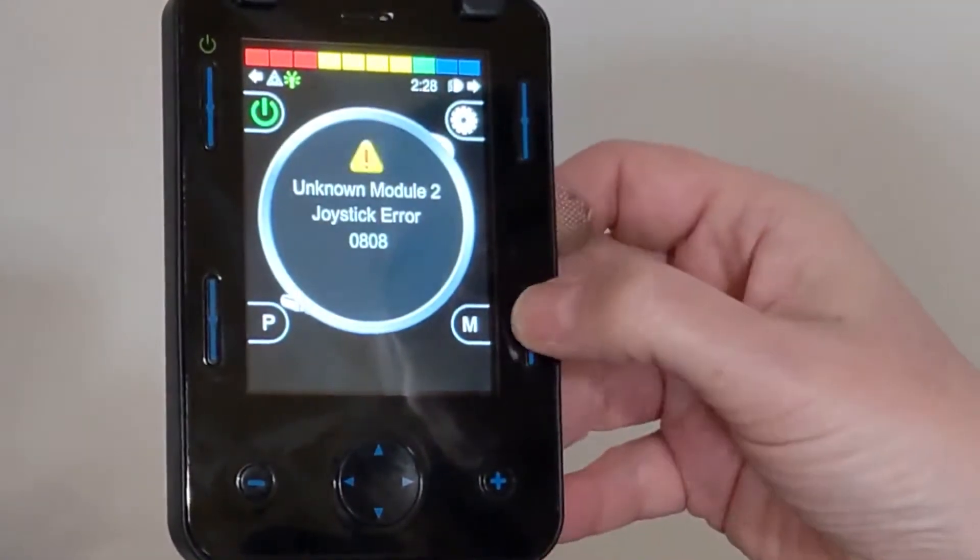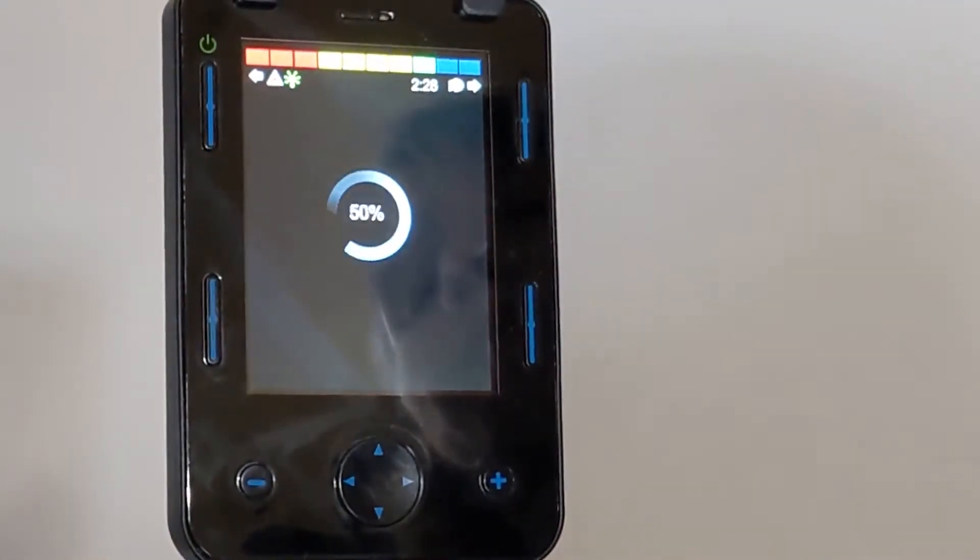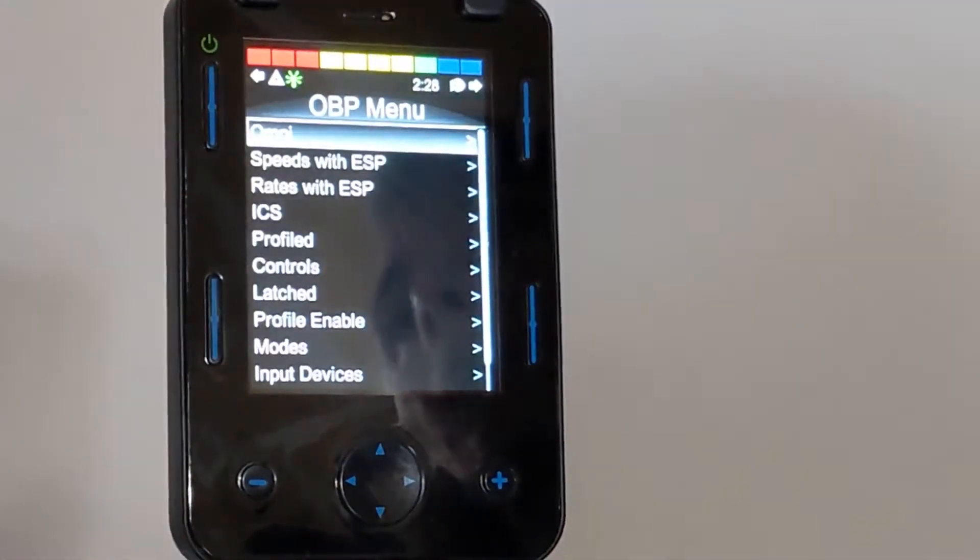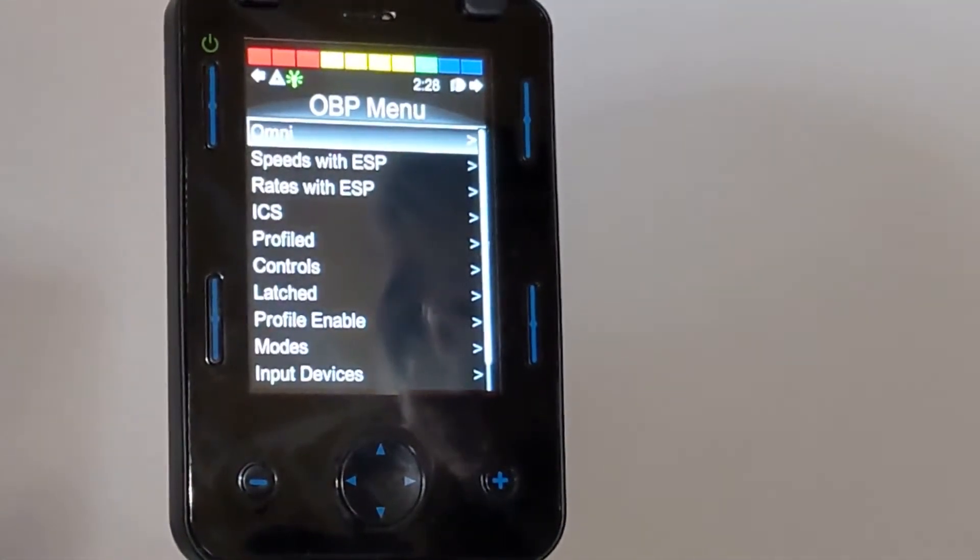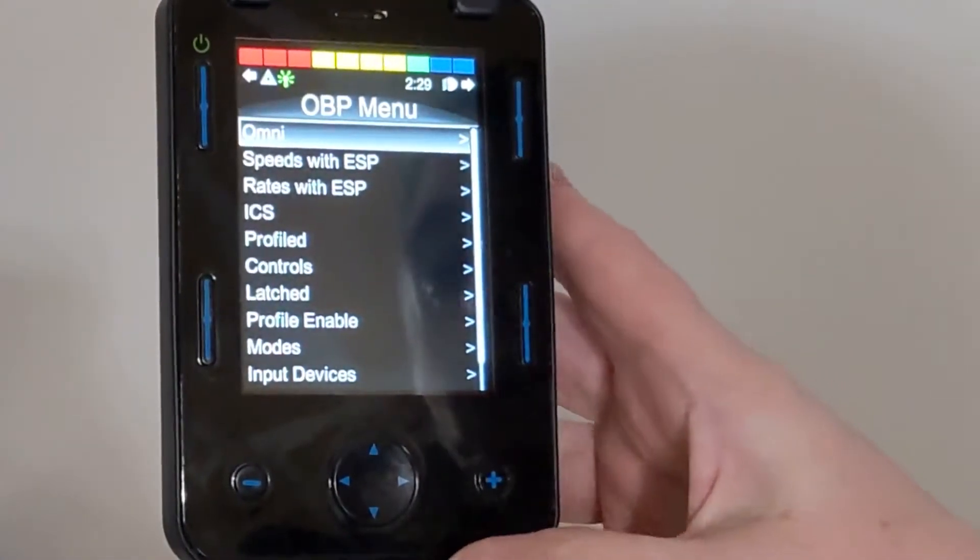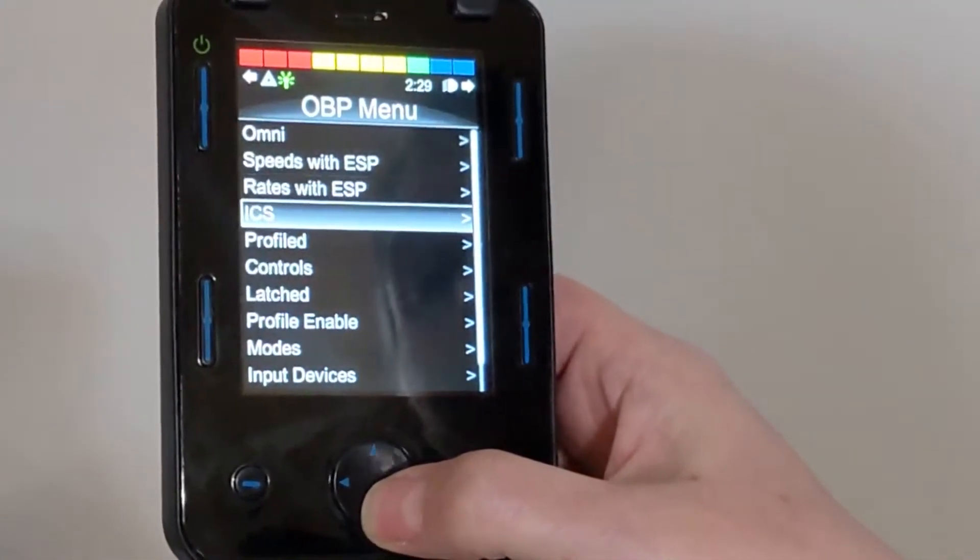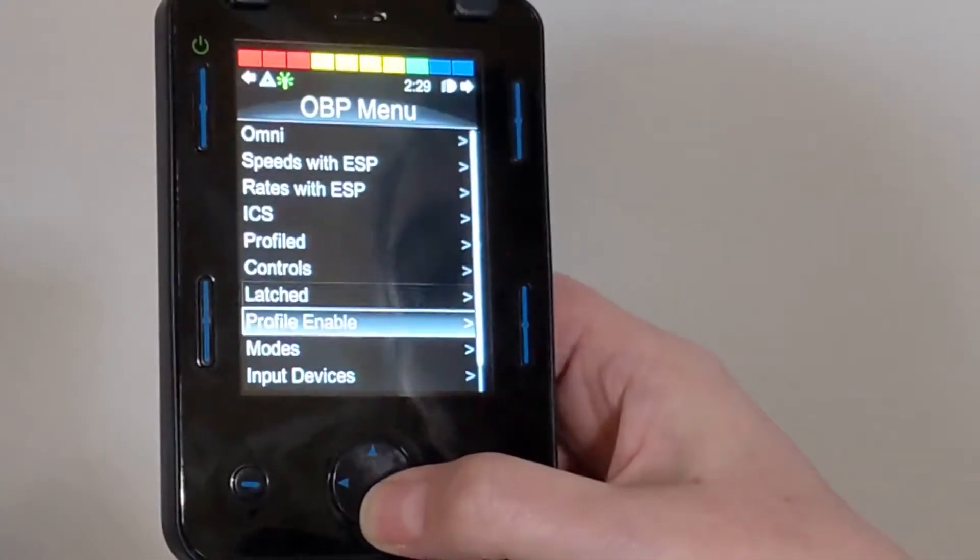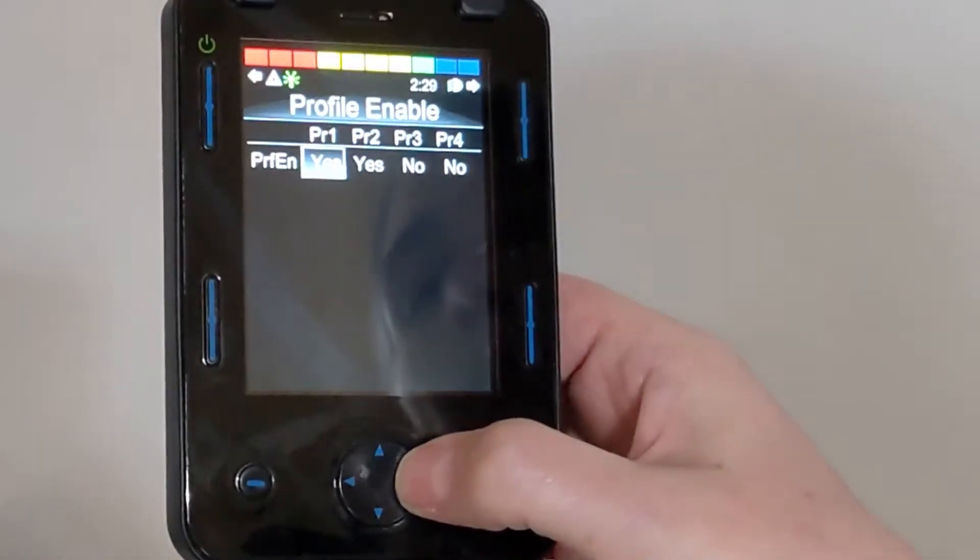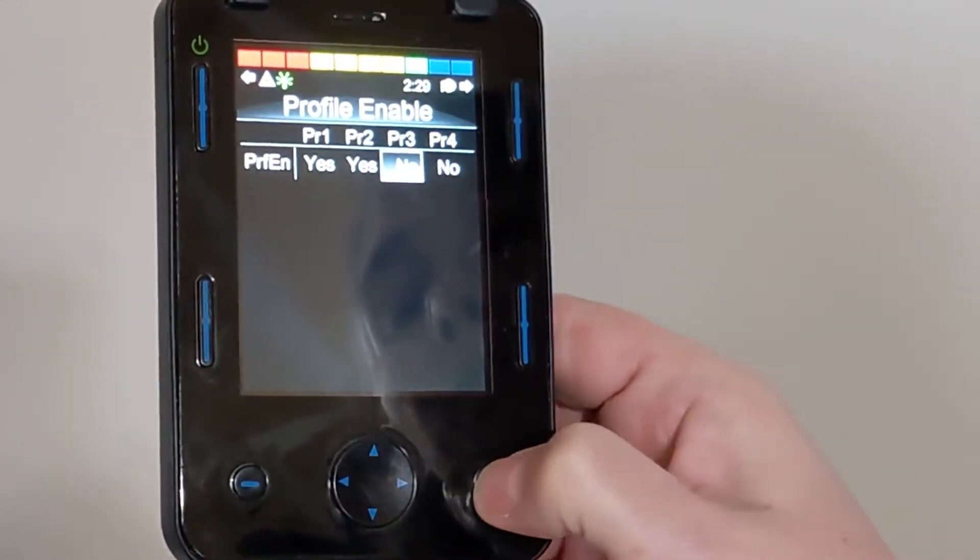We're going to start out by going to Profile Enable, and in Profile Enable, we're going to enable Profile 3.